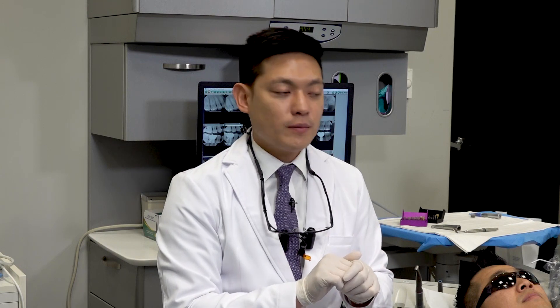We see a lot of digital impressions come into the lab with missing contact surfaces. When that happens, the restorations are going to be larger dimensionally from mesial to distal, meaning heavier contacts and more adjustments. To combat that, we need to make sure the contact surfaces are accurately captured — it's not just the prep, not just the occlusal and buccal/lingual of the adjacent teeth. It's all about positioning the camera correctly to allow the light source to reflect off those surfaces, usually rotating from mesial to distal to capture undercuts buccally and lingually.